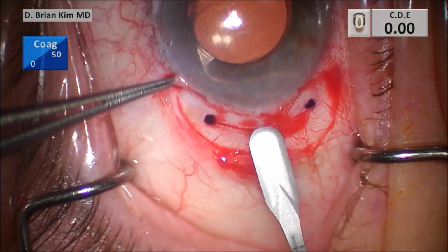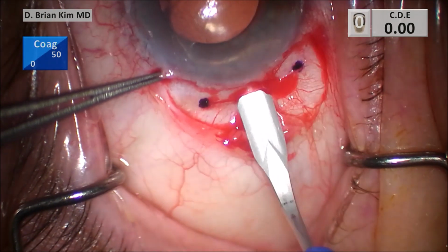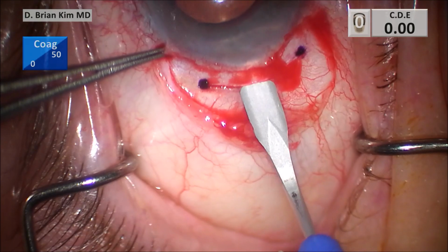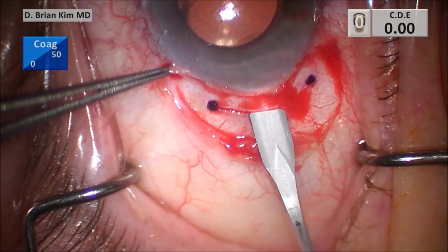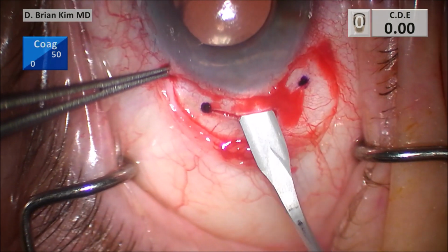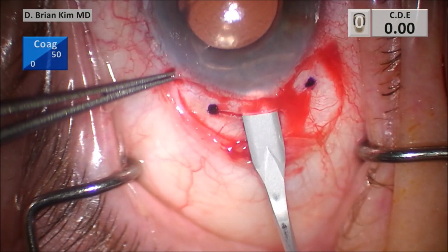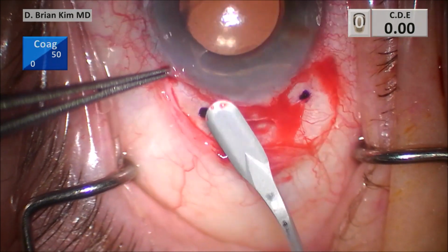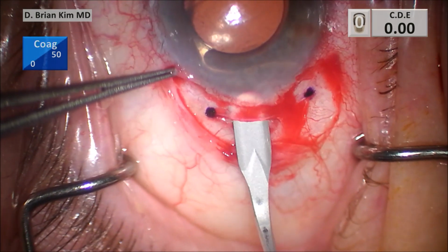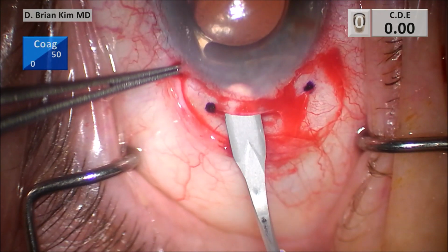You need to really make a pretty deep scleral groove. If you make a shallow groove, then you're wasting your time because it's not going to be a very strong scleral shelf. So you need to go deep enough without perforating. And then once you're in, you dig deep with the crescent blade, and you're able to find a nice lamellar plane. And then you start to very gently go across from side to side.